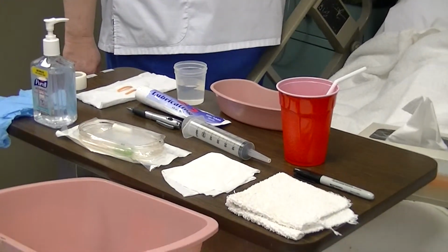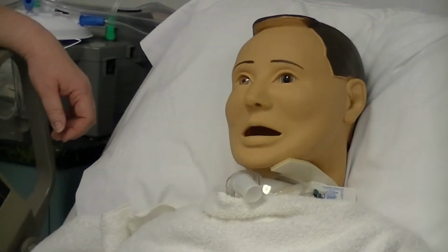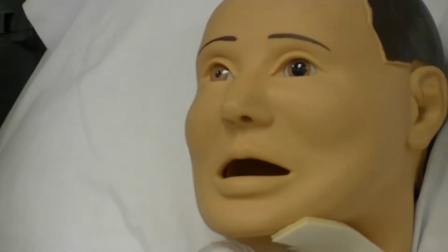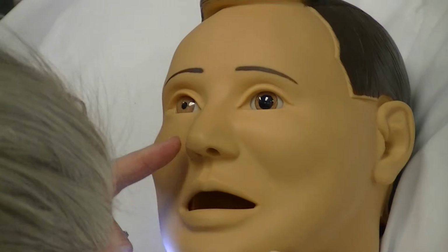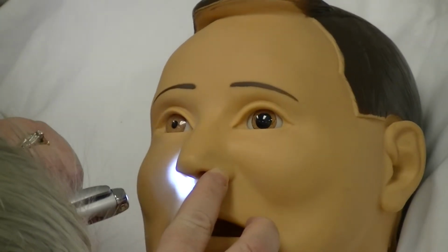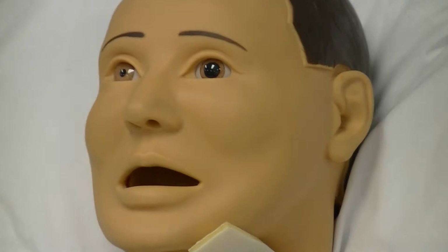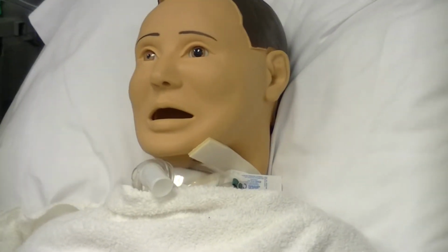First, the nurse is going to inspect the nares of the patient, instructing him to relax and breathe normally. Lay your head back and breathe normal, while occluding one naris. I'm just going to look up here. The same step will be provided for the other naris. She is checking for which naris has the greatest airflow, and that naris will be the side that we use to insert the tube.